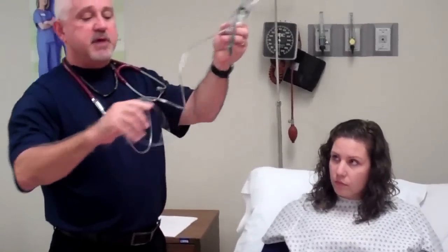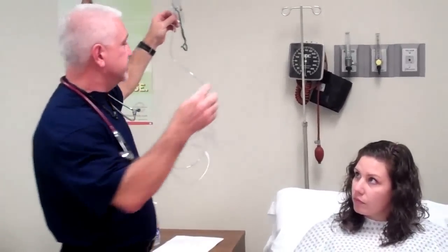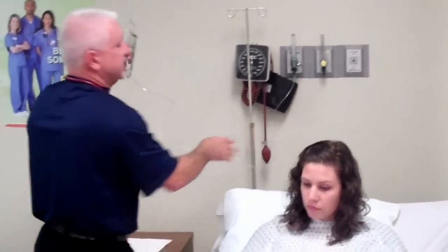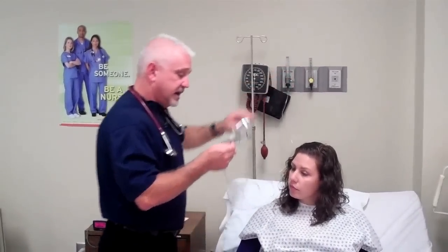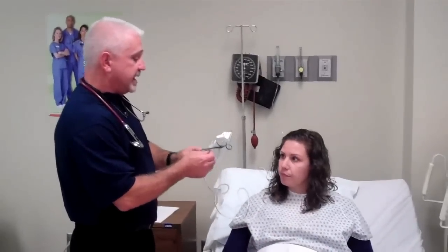This mask must run at a minimum of 5 liters per minute to clear out CO2, and a maximum of 10 liters per minute. The FiO2 range is 35% to 50%: at 5 liters per minute it delivers approximately 35%, and at 10 liters it delivers 50%. There are 5 liters between those points, and each liter increases FiO2 approximately 3%. With an order for 35%, I'd turn this on to 5 liters per minute, confirm the patient can feel the flow, and proceed to place the mask.